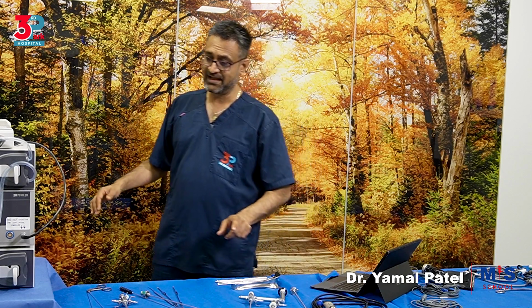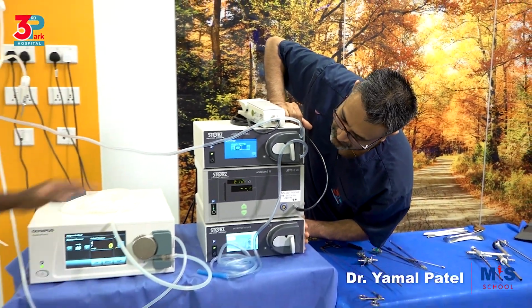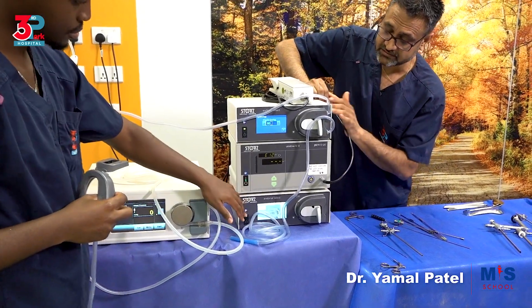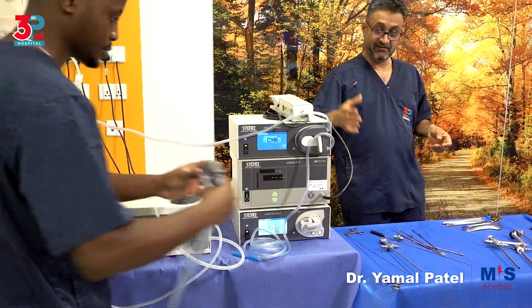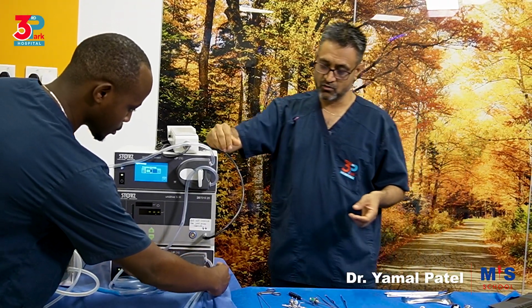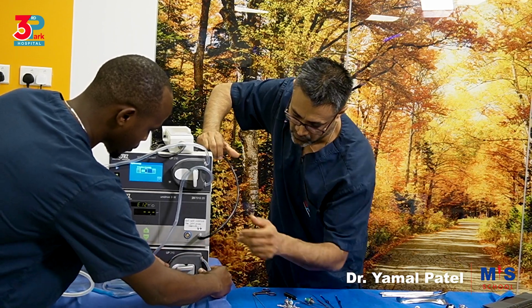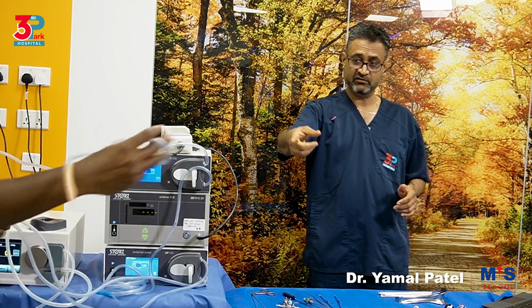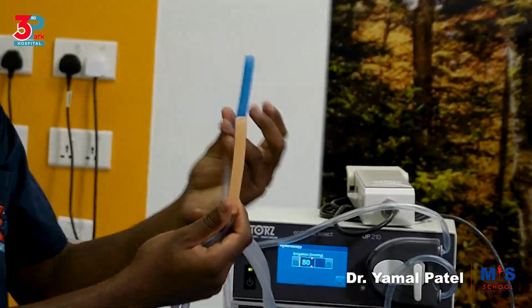So in the Bigatti Shaver, we have the two pumps. We have the in and the out, the irrigation pump and the suction pump. We have the tubings that will be color coded. So the in is always the blue, the out is the pink or the red. As you can see, the blue is the in and the other is the out.